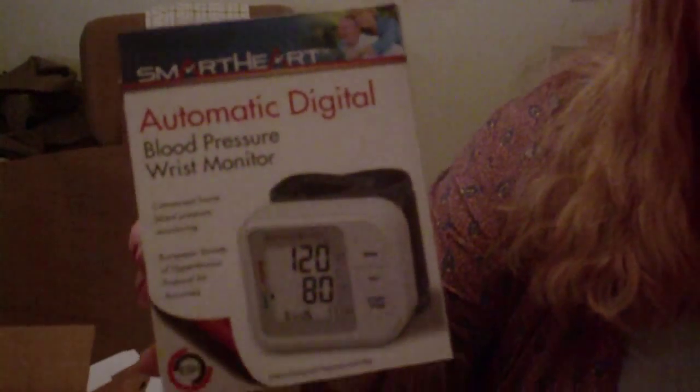A blood pressure monitor. The doctor at the clinic said I need to take my blood pressure daily, and the only way I can do that right now is to go up to a grocery store or a drug store that's two miles from here. And that's not terribly convenient.